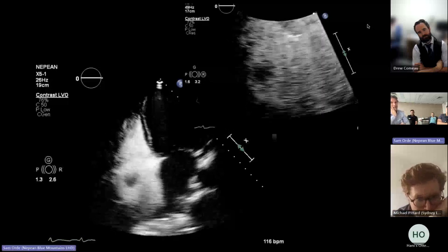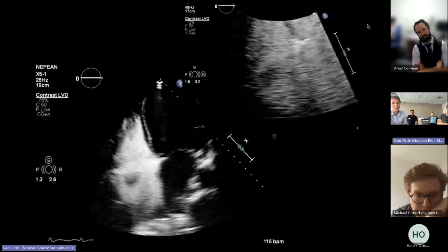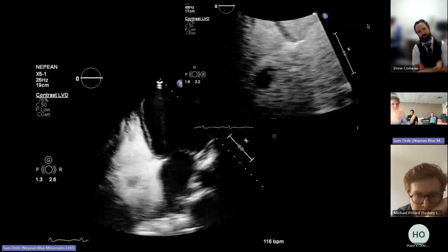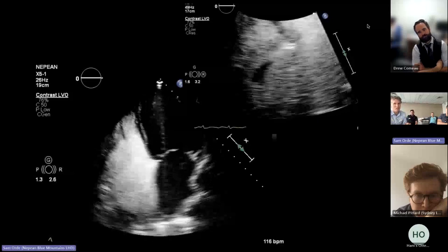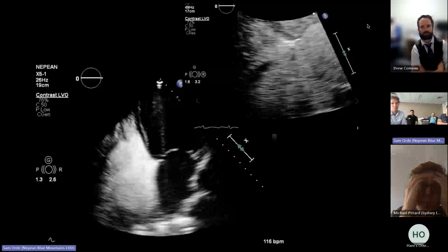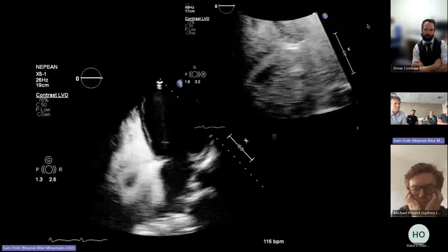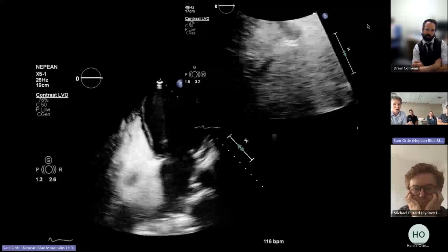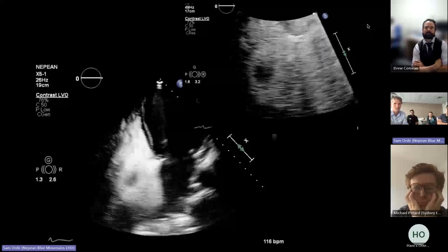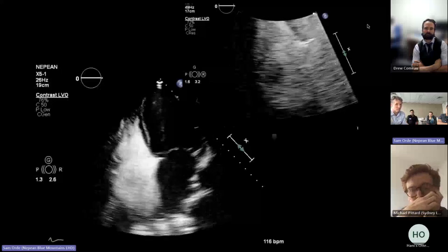And what you can see is that there's a relatively homogeneous black density to this thrombus. So there's a lack of blood supply within that thrombus, and that may suggest that there is no blood flow within it, which obviously fits with thrombus. I think that's not perfect. Again, we saw that acute thrombus in that case before. It can sometimes be hard to differentiate hyperacute thrombus probably from a mass that's got blood vessels within it. But I think on this case, we're able to look at it and say, well, yeah, that's not a tumor that we're seeing. That's a thrombus that she's got in there.